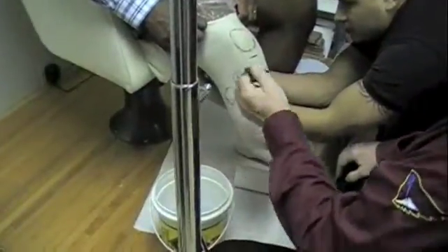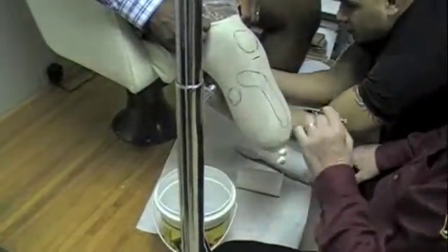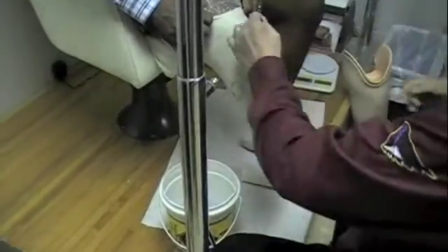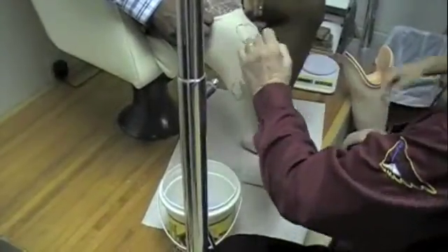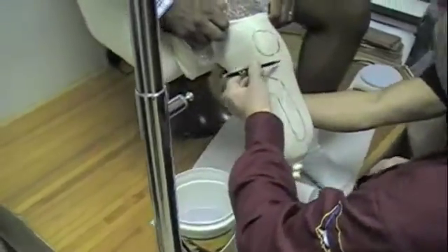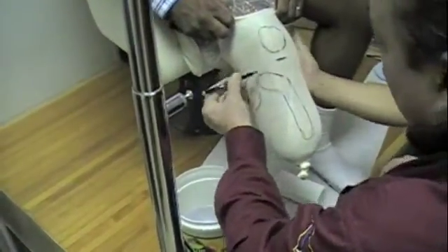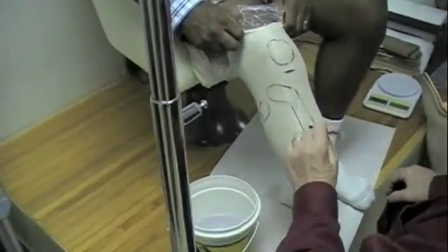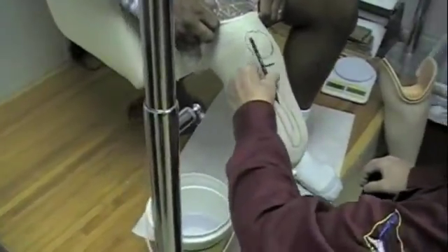What I'm doing now is marking all the bony prominences of his body that we have to address when we make the prosthetic socket. This is the patella, this is the center of the patella tendon, this is the lateral tibial flare, this is marking out the crest of the tibia, the angle of the tibia — that bone is right along there.